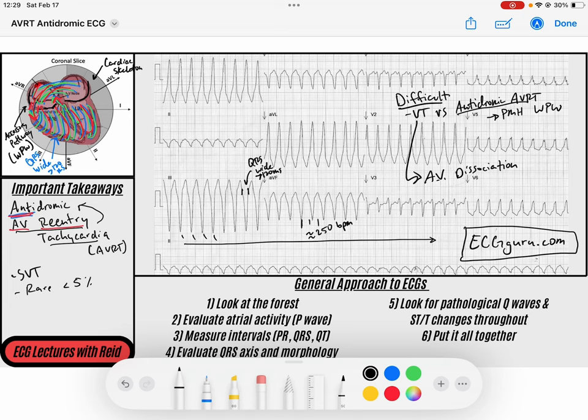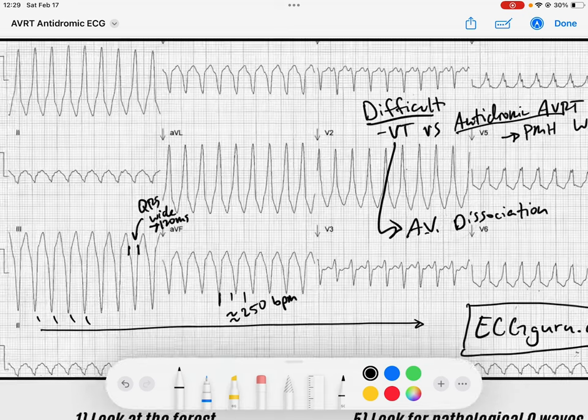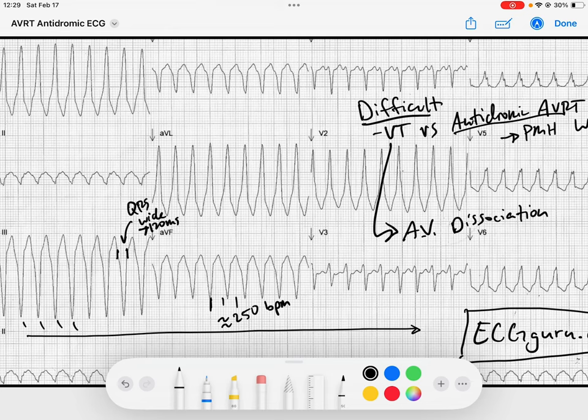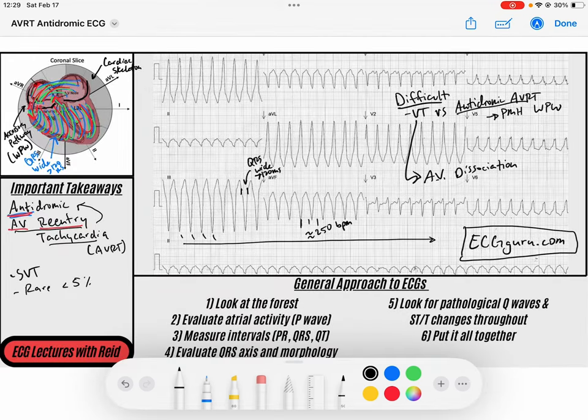And so here we see that we've got this wide complex rhythm. It's very regular. What you can actually do is, this is an advanced concept, but based on the axis of my QRS, upright in my lateral leads - leads I and AVL, V5 and V6 - it tells me that ventricular depolarization is going towards the lateral aspect. It's also negative in my inferior leads, so it tells me it's going away from my negative leads. So you can start to figure out where the accessory pathway might be.